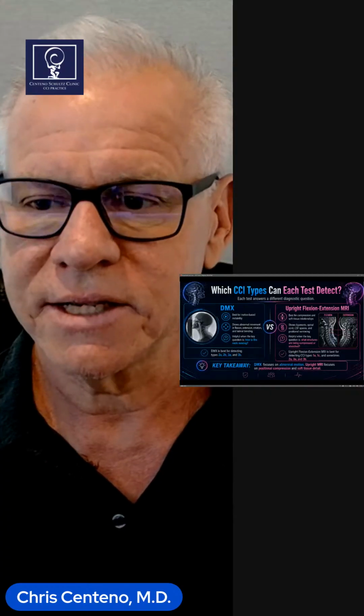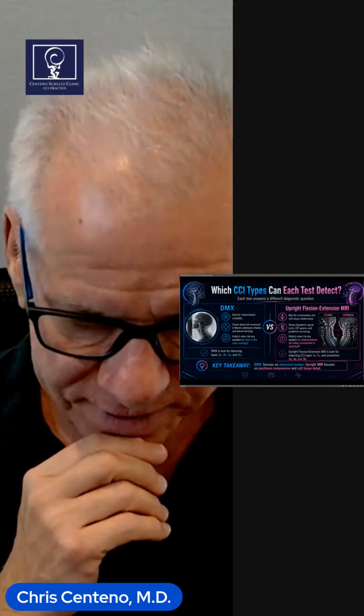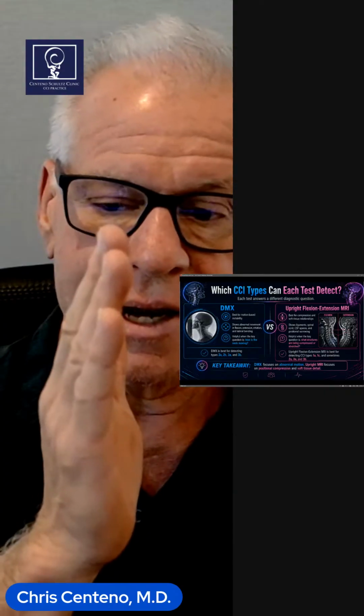So what types of CCI can each test detect? I'm going over DMX and upright flexion extension MRI. DMX is best for types 2A, 2B, 3A, 3B. For type 2A, that's when you're going in flexion and you're seeing opening of the atlantodental interspace between the dens and the atlas due to a loose transverse ligament.